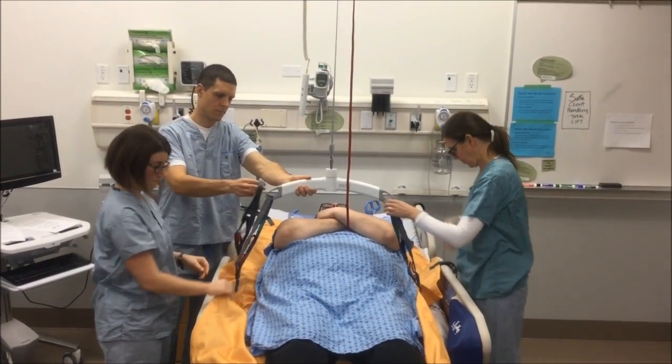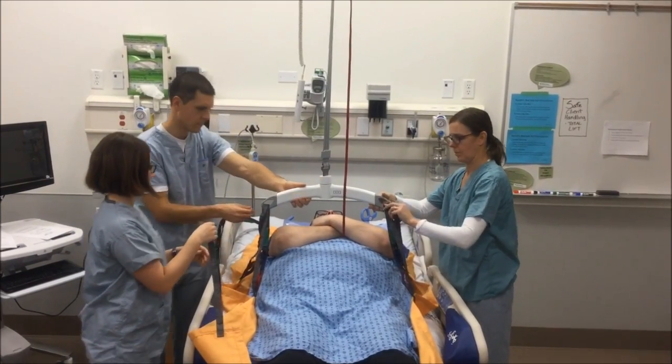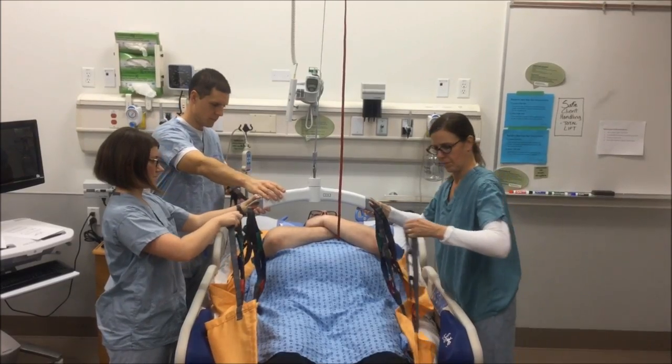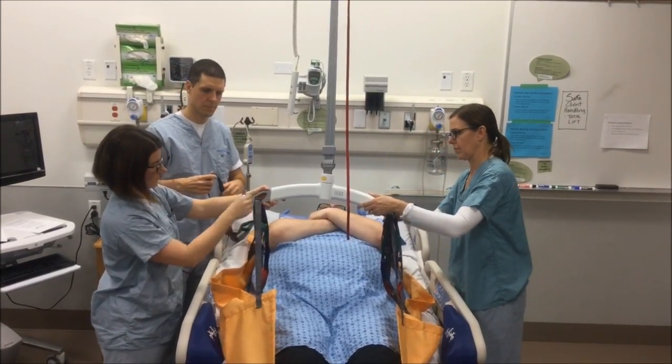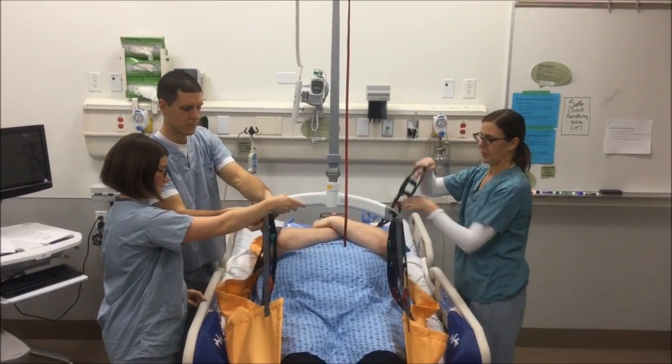For this sling, attach the middle straps of the sling to the spreader bar, ensuring that the hooks face away from the client to avoid injury. Then attach the straps closest to the feet, and finally, the straps closest to the head. Ensure that the straps are attached the same way on both sides.